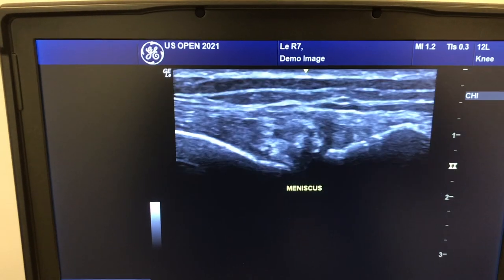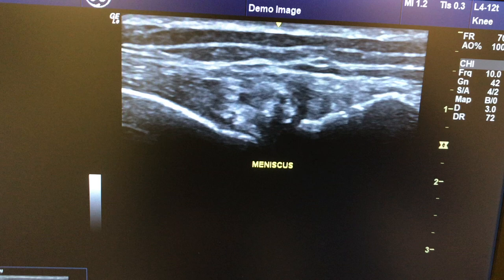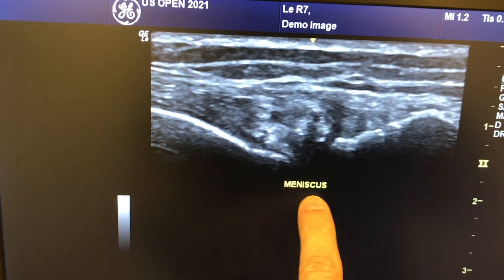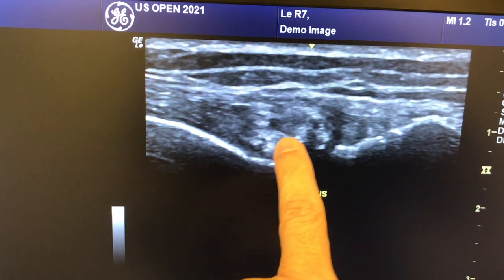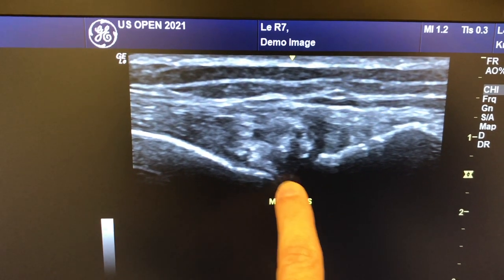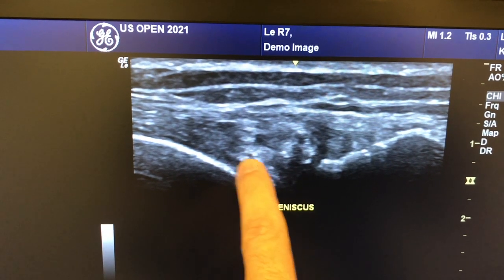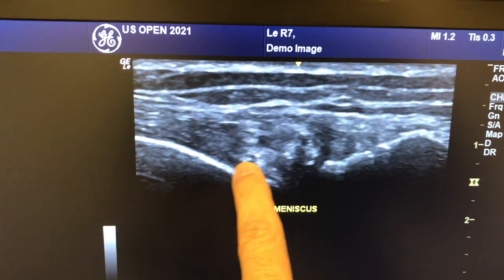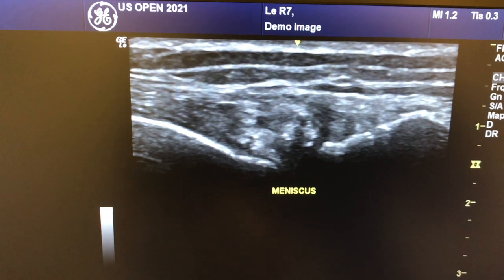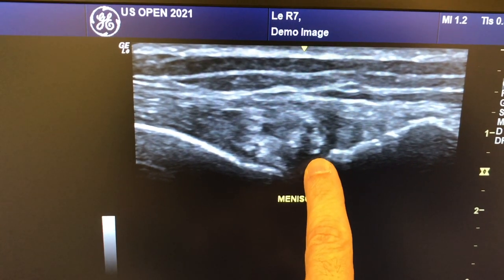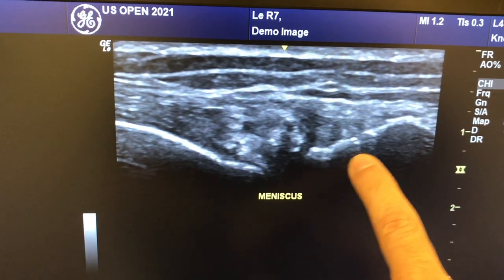On the other hand, in this knee on the lateral side in the region of the joint space, we have a very irregular meniscus — it doesn't look triangular anymore. It has an irregular shape with multiple heterogeneous echoes, and this constitutes a torn lateral meniscus that has partially extruded from the joint space. Here's the lateral femur and lateral tibia.